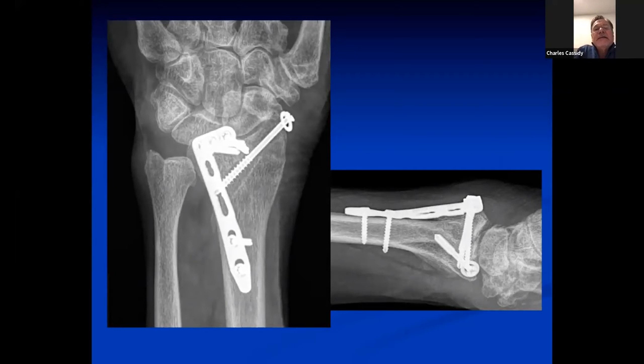That is interesting. I like it. I can't really see the articular reduction because it's obscured by the plate on the dorsal ulnar side. I think it's buttressing it and you got the radial styloid — it looks good. The lateral is not quite a true lateral, but I think you achieved the dorsal buttress of the dorsal ulnar side and the styloid fixation.